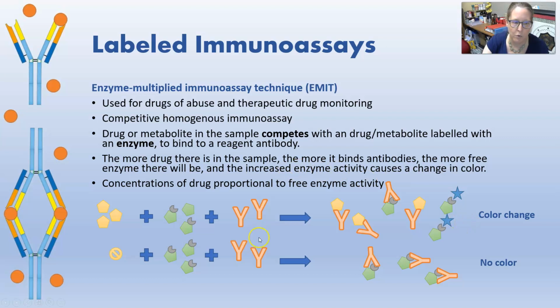So the more drug there is, the more it's going to compete and pick up all of these antibodies. And so there will be very few antibodies left to bind on the drug that's labeled with an enzyme in the reagents.